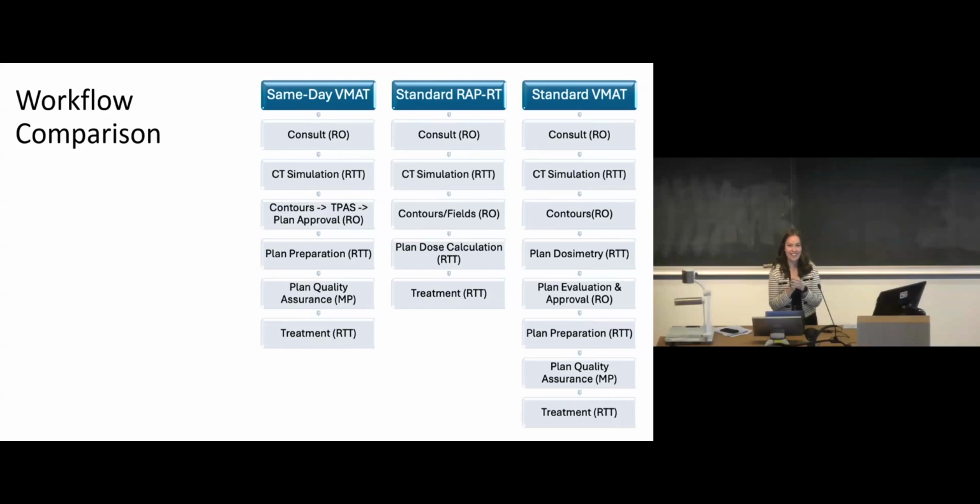It's a good question. Otherwise we would be setting a POP for these patients, so a similar amount of time to an unplanned technique, but with the increasing use of stereotactic techniques and SABR, we certainly have lots of contouring on those plans. But it does bring up a good point that by streamlining this process, as we move into more complex treatments in the oligometastatic setting and more SABR, it does free up time to work on those more complicated cases as well.